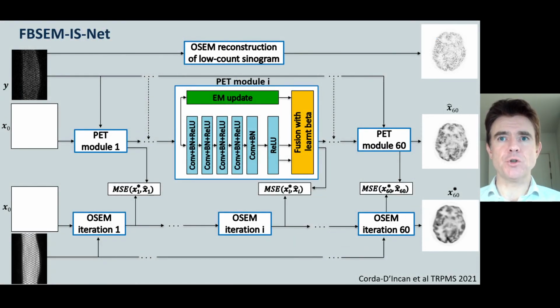So I just want to touch on another thing that can be improved upon here, which is to use iteration-dependent networks along with iteration-dependent loss functions and targets. So here now, instead of just going with the last endpoint training here, so this is initial image going through all of those different modules, and then we get a reconstructed image out the other side.